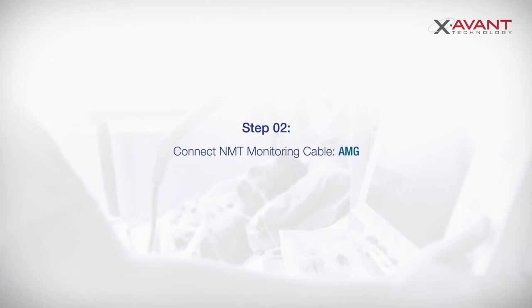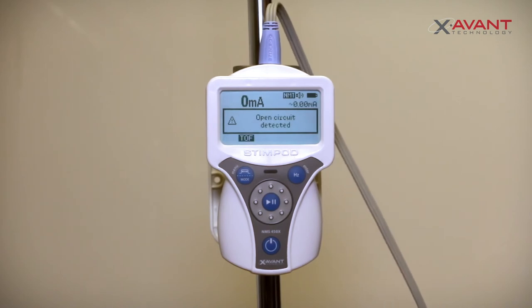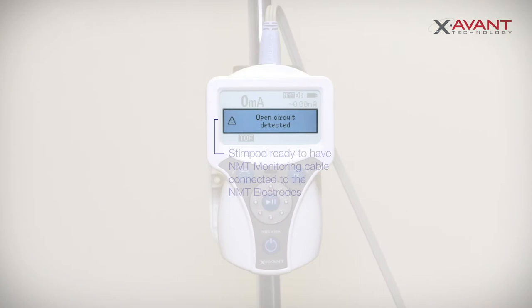Connect the NMT monitoring cable AMG to the Stimpod. An 'Open Circuit Detected' screen prompt will appear. When the LED on the accelerometer changes from red to blue, it confirms that the accelerometer has passed its verification test. The Stimpod is now ready to have the monitoring cable connected to the stimulation electrodes.